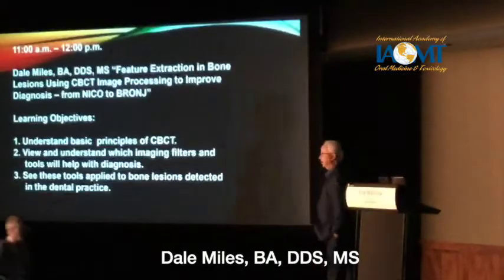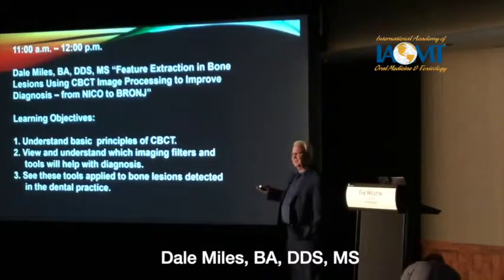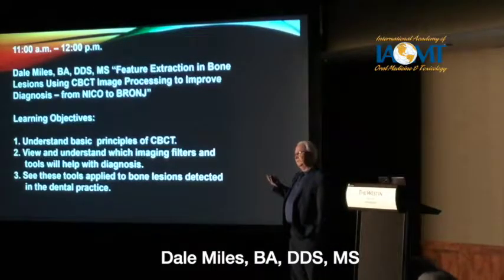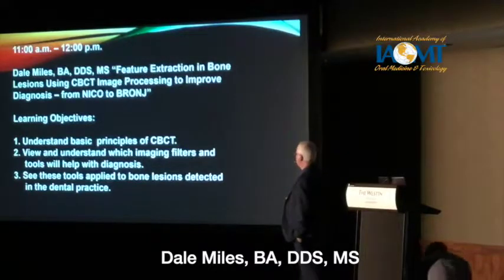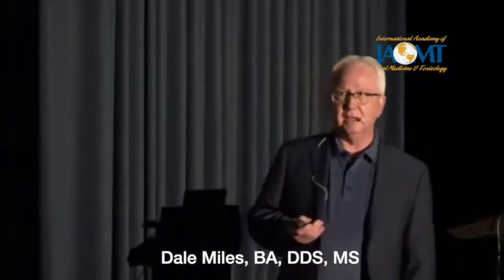All right. The only thing I cannot do is take you through the basic principles of CBCT. If anybody was thinking they were going to hear that in the first part of the talk, good luck. I do a 1.5-day program at Gordon Christensen's and a 2.5-day one in Toronto every year, and I barely get through the content. If you want to look at my lecture schedule, I've got a website, drconebeam.com, and it's all spelled out. But I am going to show you some of the images in the back part of the talk of things we can do with cone beam.